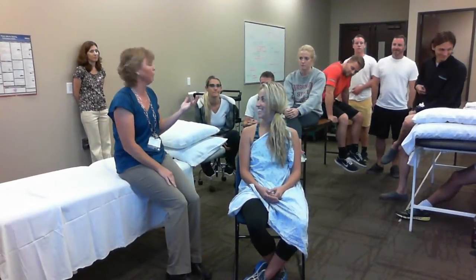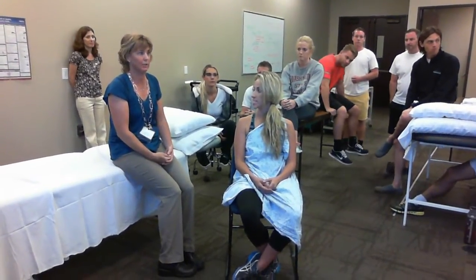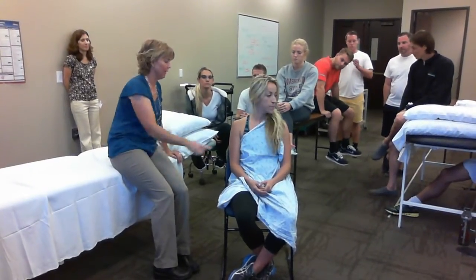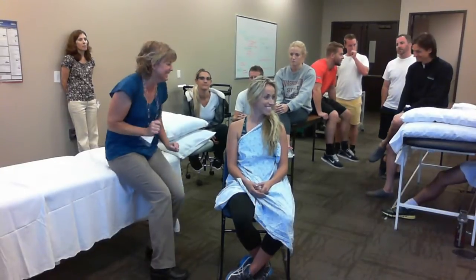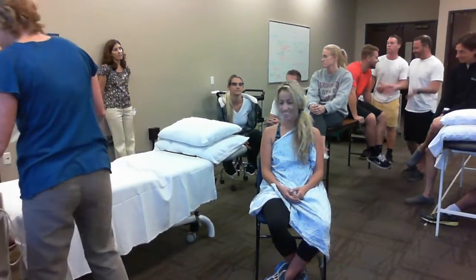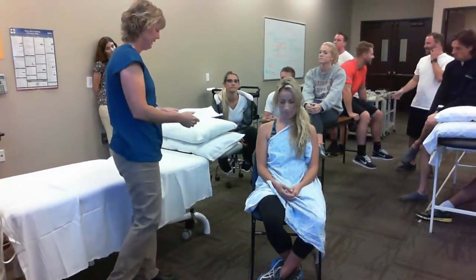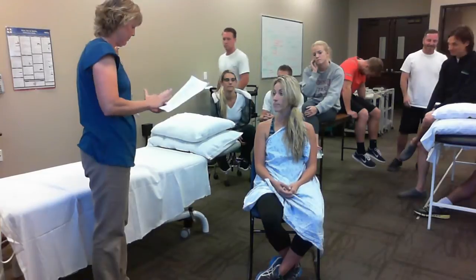So as an aside, I'm going to be placing, pretty much 4 electrodes around her shoulder. So I want to test where I'm going to be placing those electrodes especially. So go ahead and look away. So if I do one there and one there and one there. Sorry. But also wherever the cold pack is going to be and or the hot pack when we get to that. Great. Okay. So that looks good.